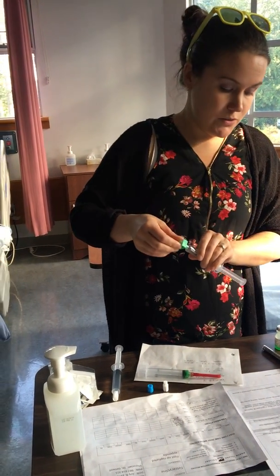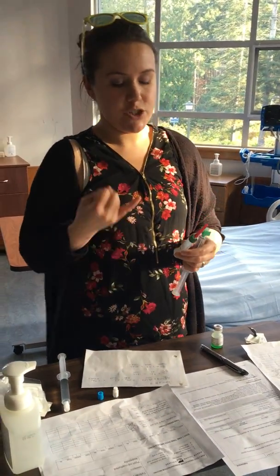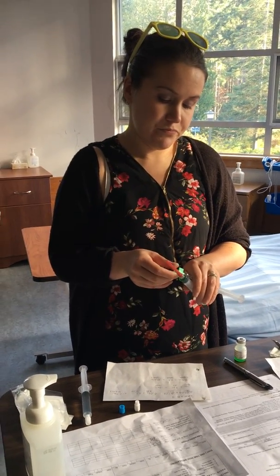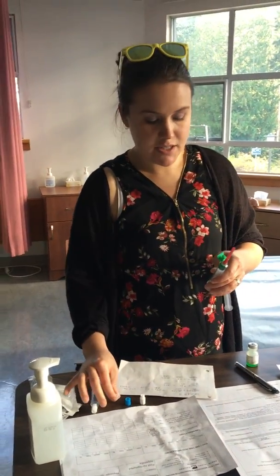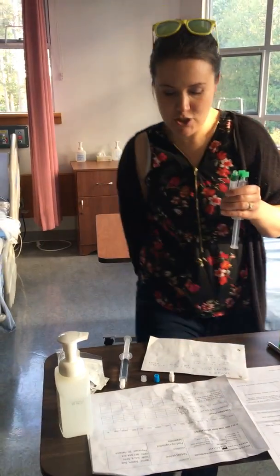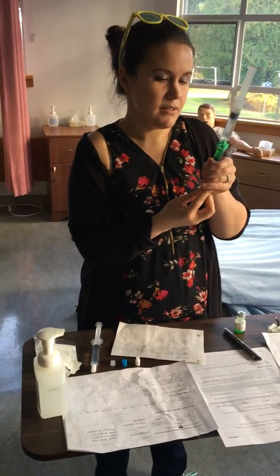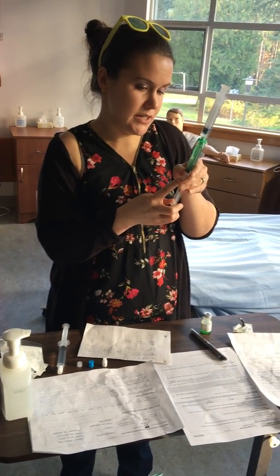And then I'm going to do my second check on my medication because I have it drawn up. So second check, 7 rights. Okay, perfect. And I'm going to double check my math with the second nurse. I'm going to take this off, and throw it directly into the sharps. It's in the sharps now. And connect this using clean technique, and I'm going to pull back so that I have 10 milliliters in here. So now I have my desired concentration.